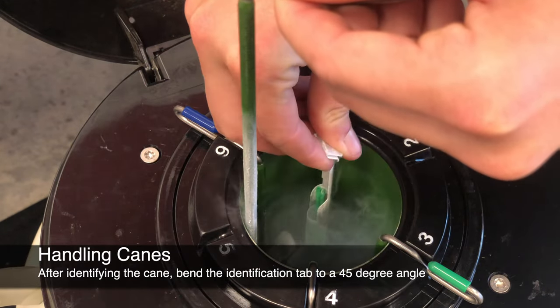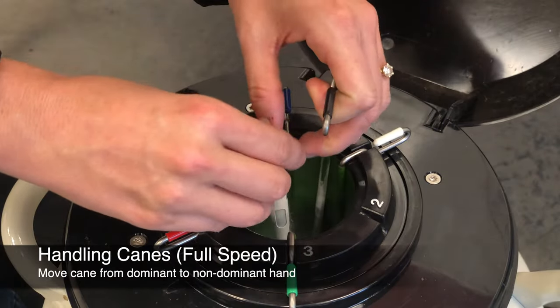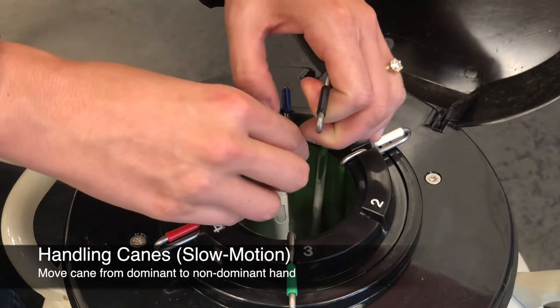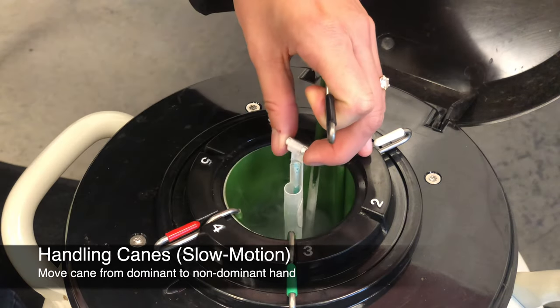After identifying the cane you want to retrieve the semen from, bend the identification tab to a 45-degree angle. Raise the desired cane slightly with your dominant hand while lowering the canister slightly with your non-dominant hand. Then grasp the top of the cane with your non-dominant hand so that your dominant hand can remove the desired straw or straws from the cane.